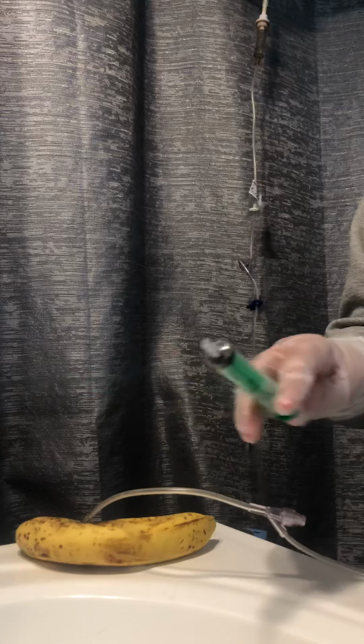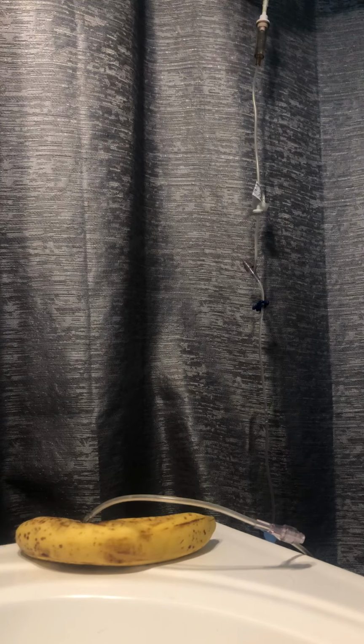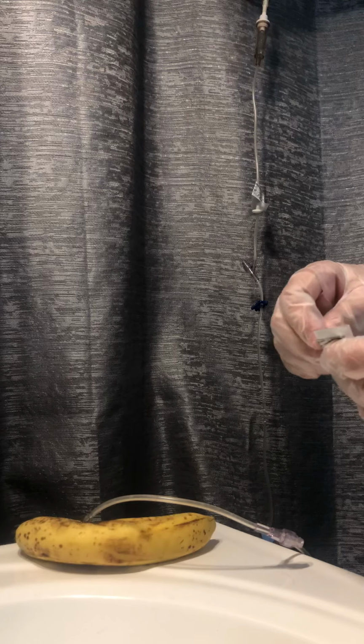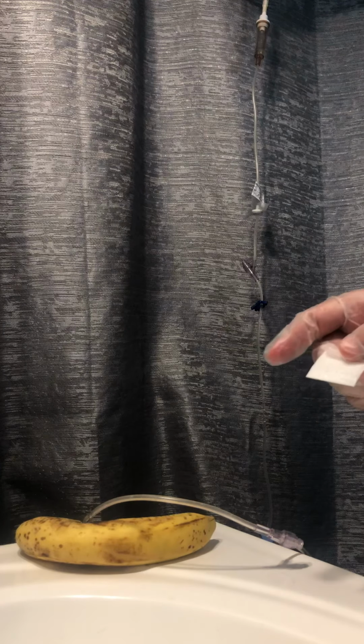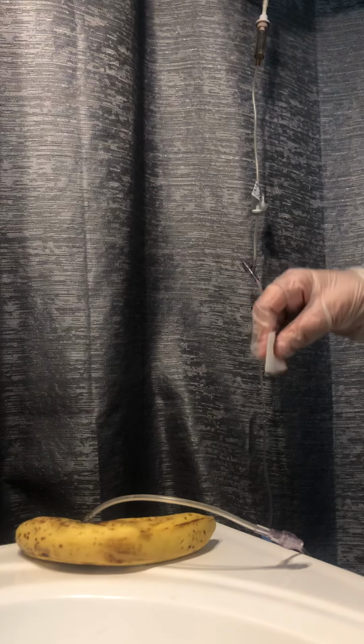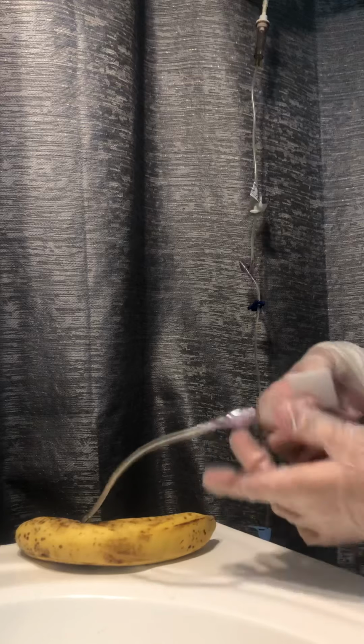We're going to do our last normal saline. Again, new alcohol pad. For the last normal saline, it's going to be at the same time frame as the medication. So we're going to do 2 milliliters over 2 minutes, at 0.5 over 30 seconds.